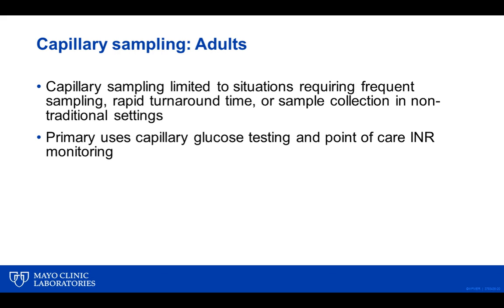The use cases of capillary sampling in adults do differ from infants and children. Again, there are plenty of adults who have a fear of needles who prefer not to have a venipuncture, but for the most part in healthcare, we just ask the adults to suck it up basically and say, okay, we'll put you in a chair and lie you back if you feel like you might faint, but most of the time we want to get venous blood from adults.